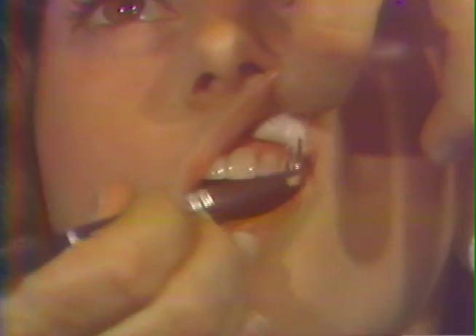I will now demonstrate the cotton roll placement for the anterior superior dental nerve injection. Turn your head just a little bit towards me. Open a little bit wider. Relax your lip and cheek. Open a little bit wider. This is now placed in the area opposite the teeth you intend to inject. Now close your mouth. These are topical placements for the left side of the maxilla. Now open your mouth.